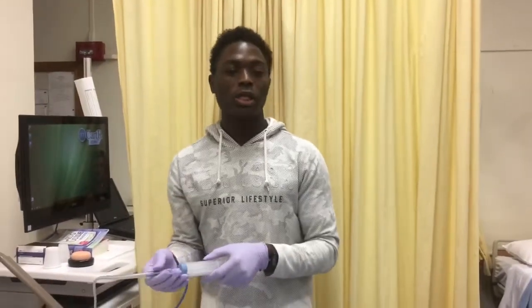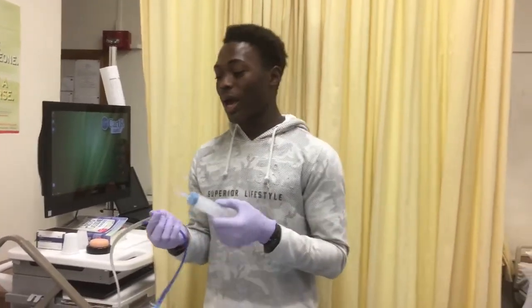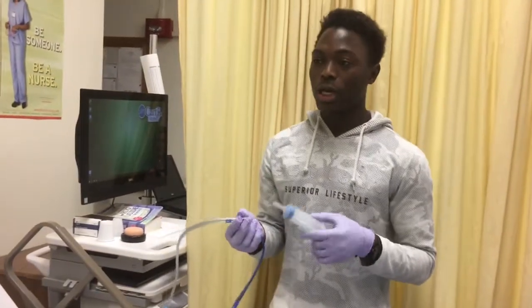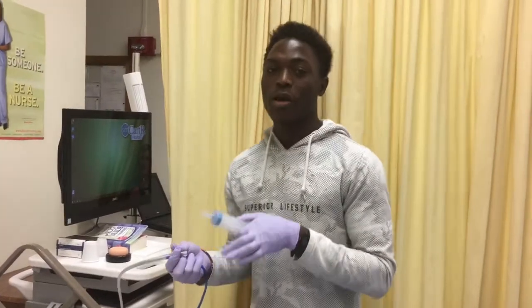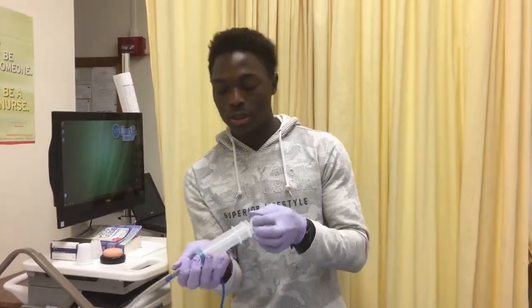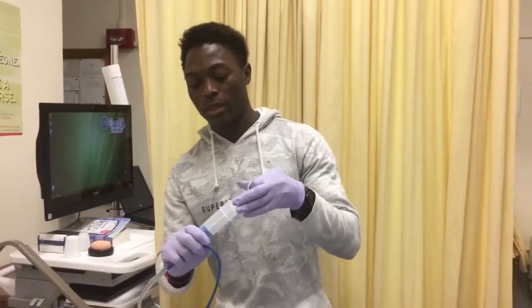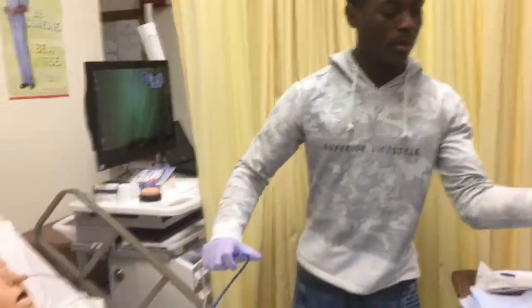And you can also do the residual. The residual is the food that is left in the patient's stomach after the 4 hours. So after 4 hours, she had 400 milliliters of full liquid, and now I'm gonna check for residual. To do this procedure, you're gonna remove all the food content that's in the patient's stomach. It's a continuing process. Put it in here.